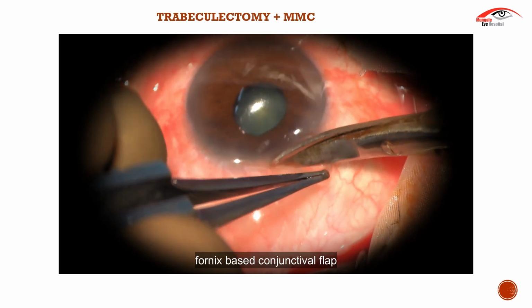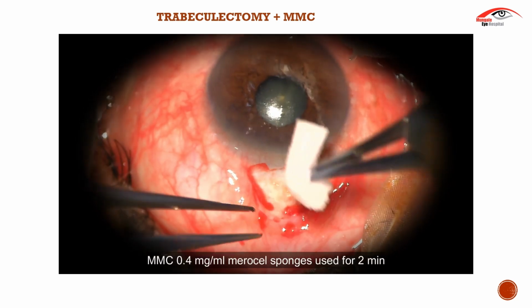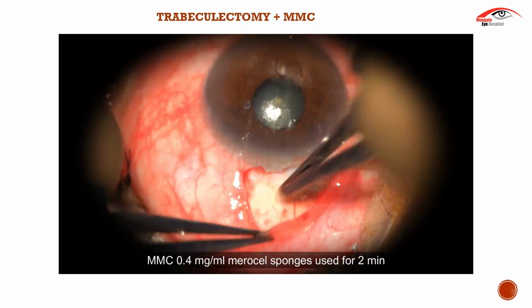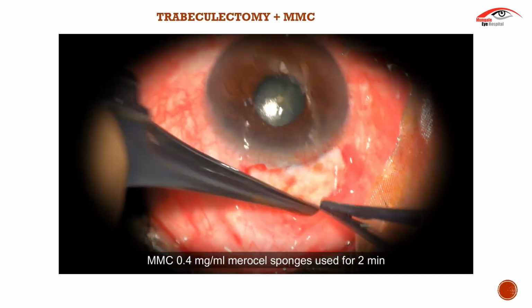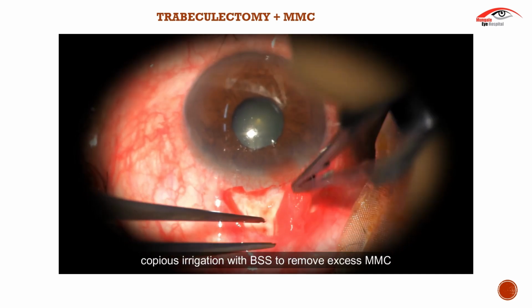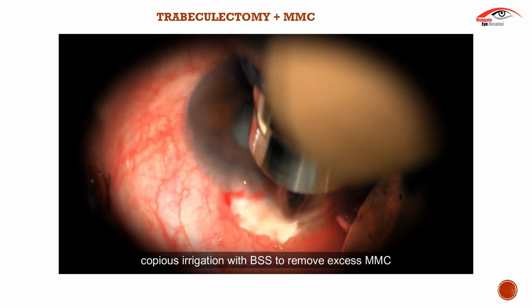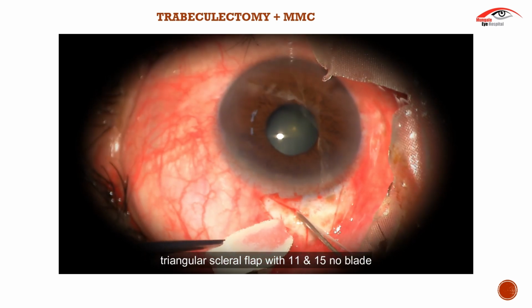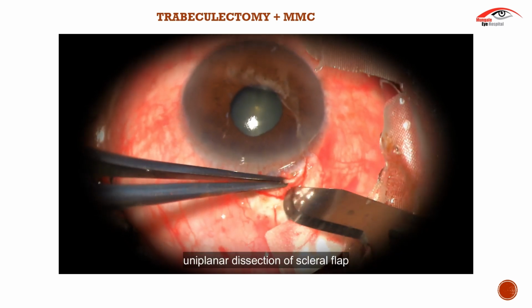After adequate exposure of the eye, a fornix-based conjunctival flap is made. After achieving hemostasis, 0.04% mitomycin C soaked merocel sponges are kept in the subconjunctival space for a duration of 2 minutes. After a thorough wash, a triangular flap is created and a uniplanar dissection is ensured up to the surgical limbus.